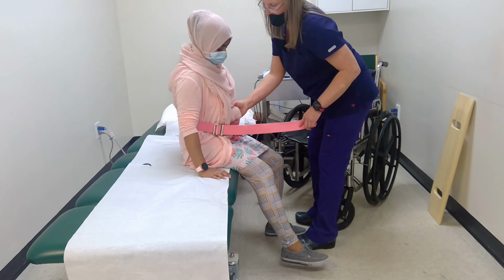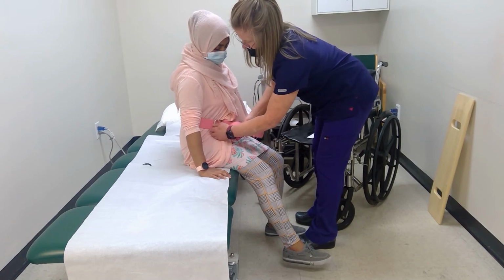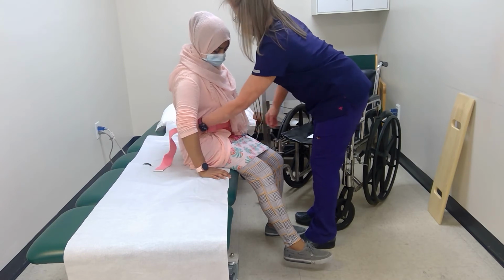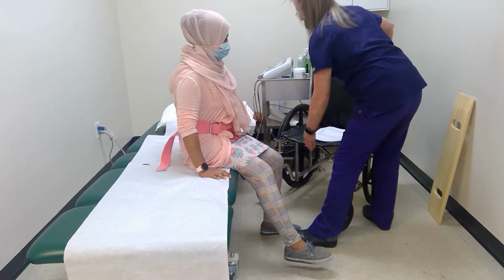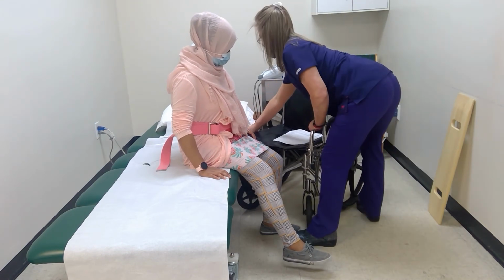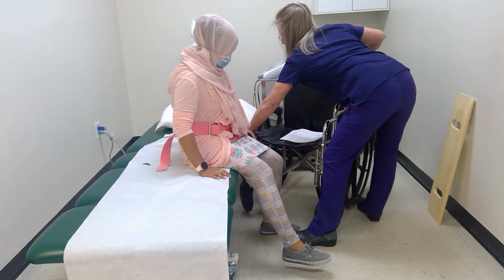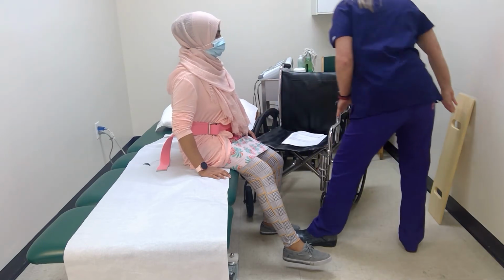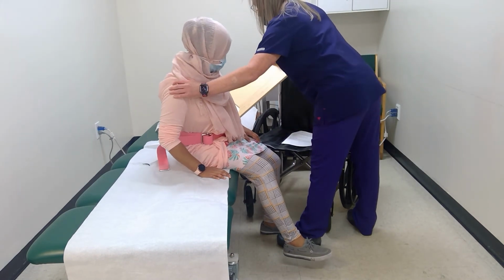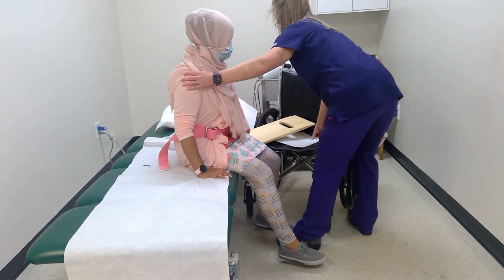So to perform a transfer to the wheelchair using a sliding board, make sure that the patient has their balance a little bit. And I'm going to angle the wheelchair at about 45 degrees. This wheelchair doesn't want to walk. There we go. And then I'm going to take the sliding board and have her go ahead and lean over a little bit. There you go.